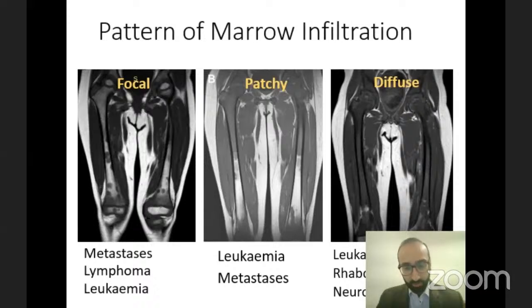Now again, neuroblastoma is only one of the causes of diffuse metastases. Osteosarcoma, rhabdomyosarcoma, Ewing's, they're all there. But neuroblastoma and rhabdomyosarcoma are just more likely to give you a diffuse pattern, and that's why I've mentioned them, just for you to have in your differential. And in the case of the neuroblastoma, we ended up doing an ultrasound and a CT to confirm a left adrenal tumor.